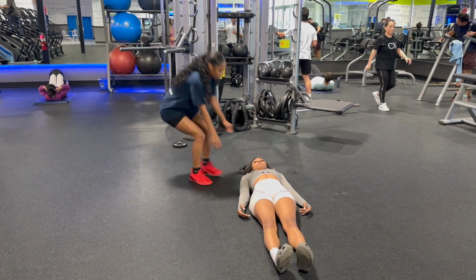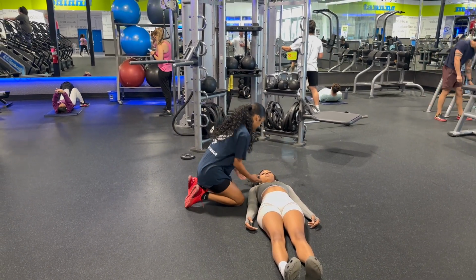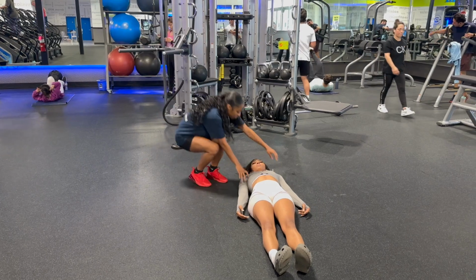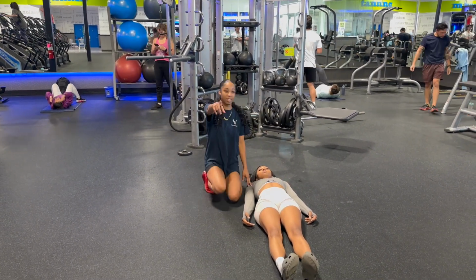See a person on the ground and think that they might need some help. You've surveyed the scene and it's safe to approach. Shake their shoulders and ask, "Are you okay?" Point to someone and tell them to call 911 and bring the AED.